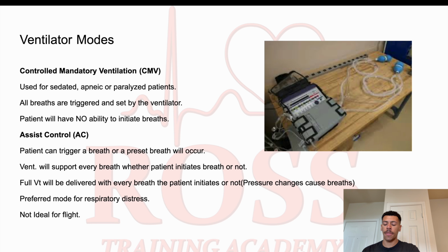And so this one typically is not going to be good for flights or if you're riding in the back of an ambulance, just because every little bump, every time the patient makes any type of sound or tries to make any type of sound or sucks in at all, that full breath is going to be given to that patient. And so every single bump, you're going to be giving that full tidal volume to that patient, and that'll start damaging the lungs and causing barotrauma or breath stacking. But you will typically see AC started for patients that have respiratory distress, and we'll start them there.